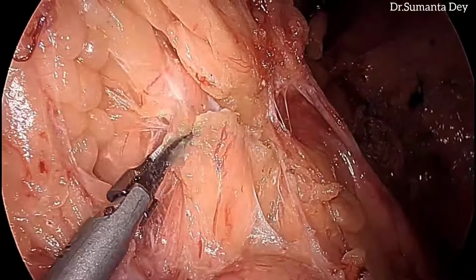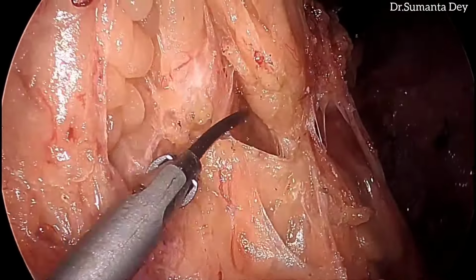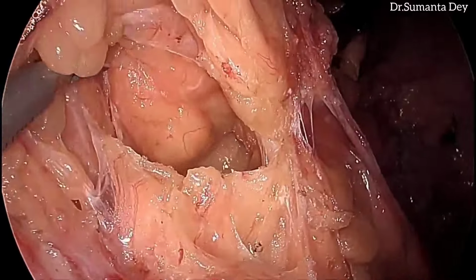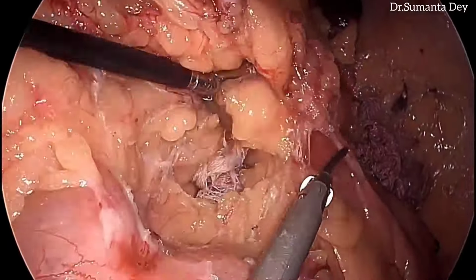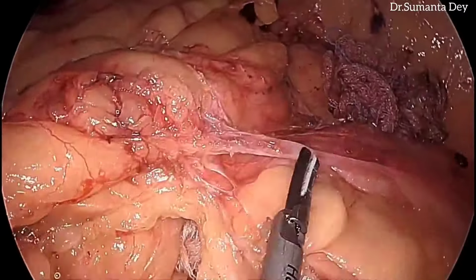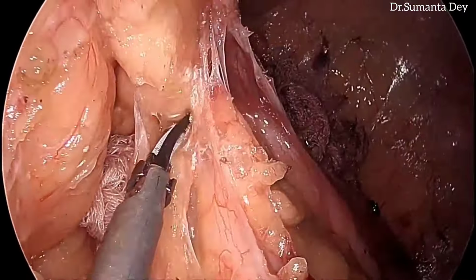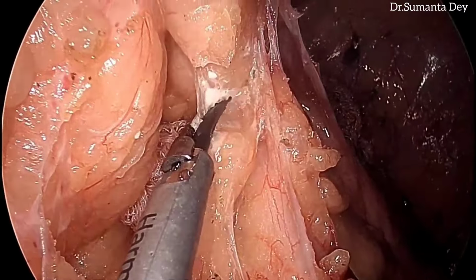So now you can see a glimpse of that gauze piece. Now I'm sure that I have entered into the correct plane. So that is the gauze piece that I have kept into the lesser sac. That is the plane of dissection. So the remaining part of the mobilization can be easily done now.